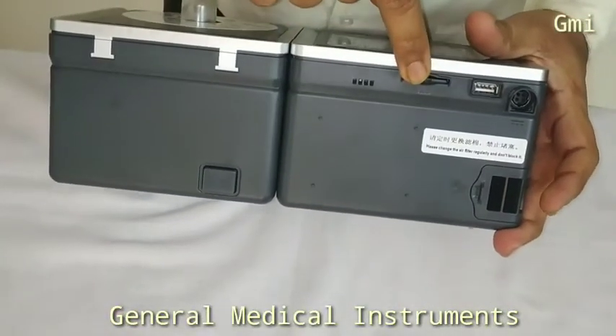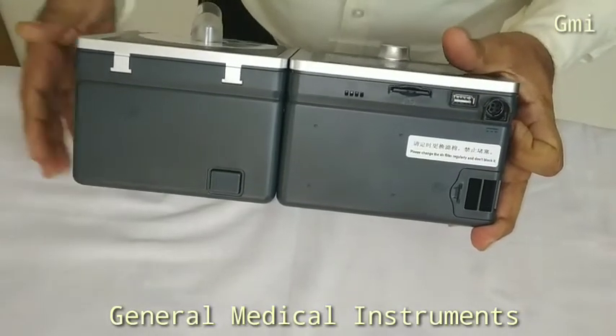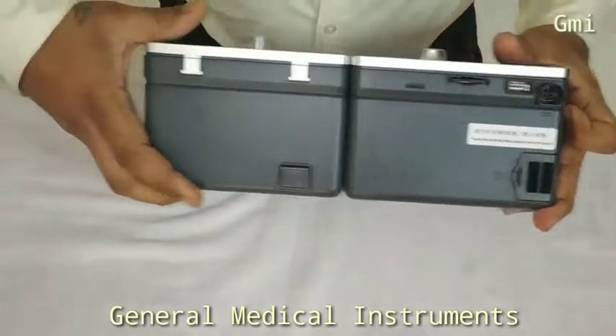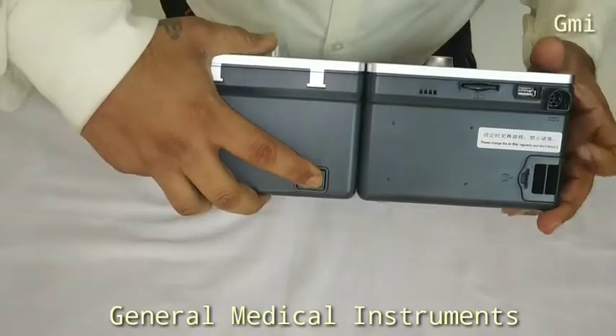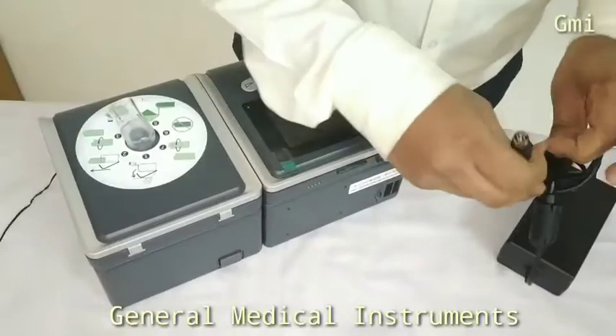SD Card. USB. Power Supply In. Humidifier Module Eject Button. Power Adapter Setup.